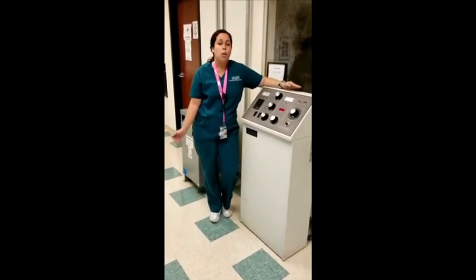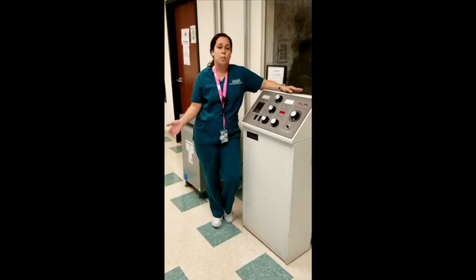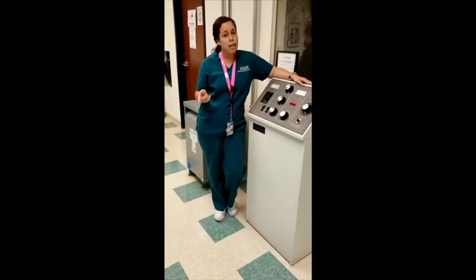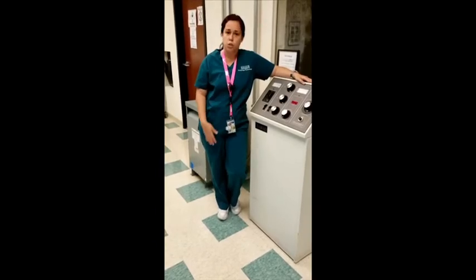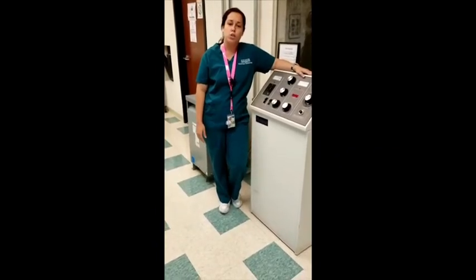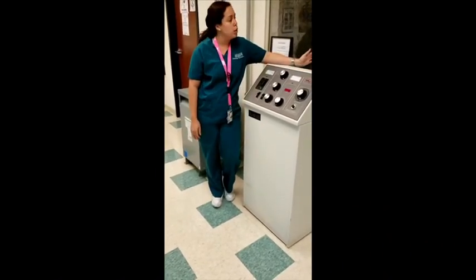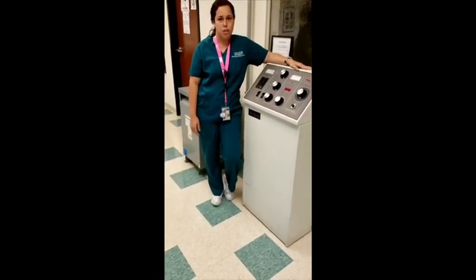All in all, we understand as radiographers that the point is we need to try to reduce as much scatter, and not just scatter, but reduce patient dose. So we need to try and choose the correct factors and have knowledge as to what we're doing when we're in the room and with our patients.